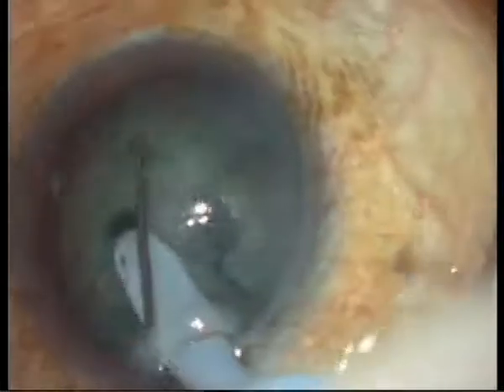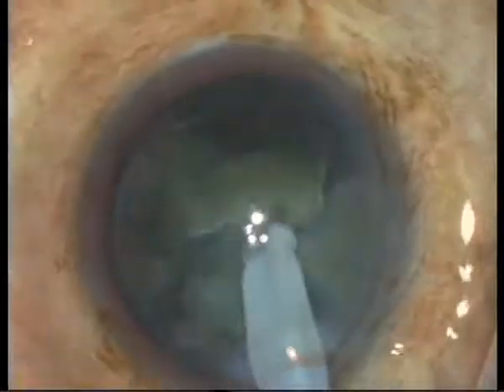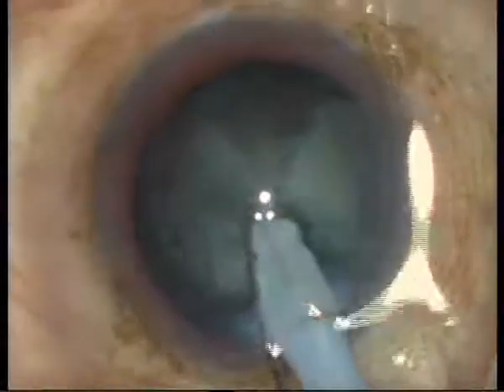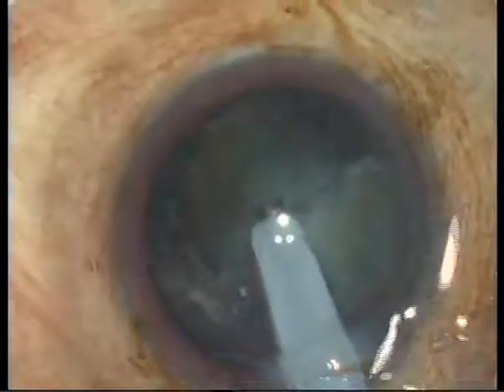Then you can already switch to the next step — segment removal. I use the side port to orient the pieces if they are a little bit too mobile, but this is not the case apparently. They are coming up very well. These are the parameters — they are adjusted and put into this machine.